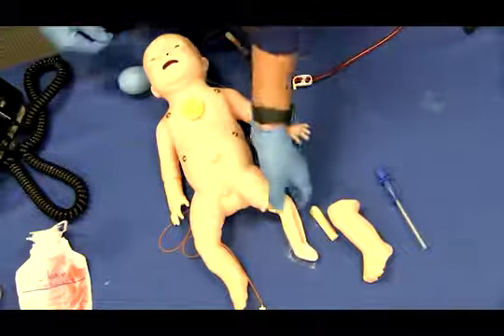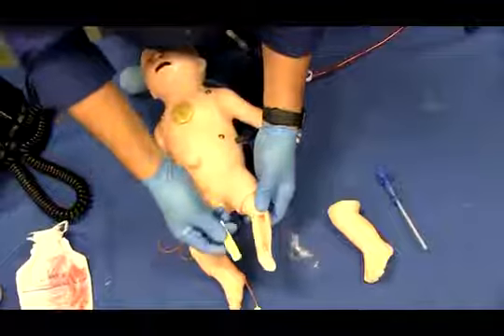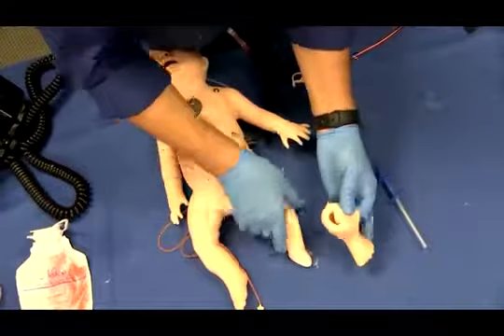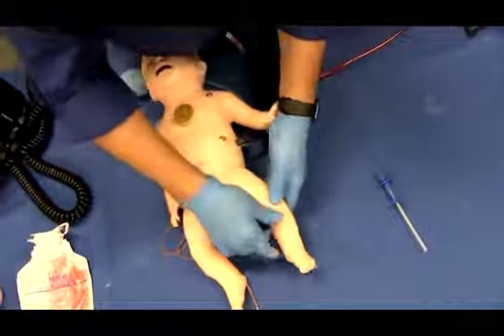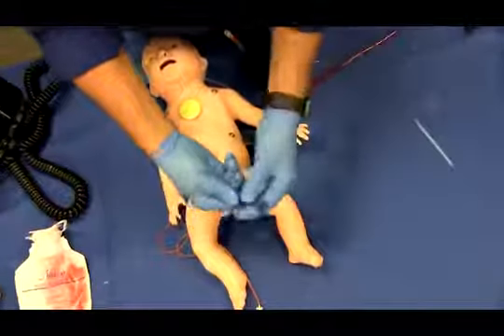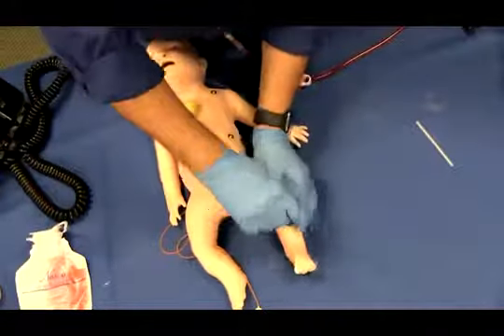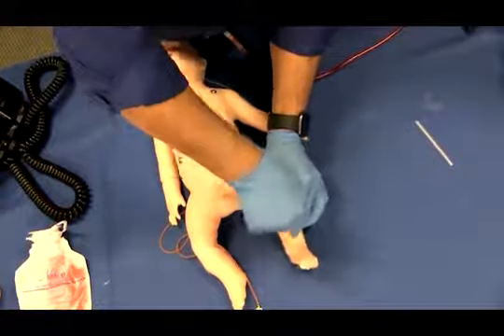Intraosseous infusion. Charlie's left leg incorporates an intraosseous infusion feature. Install the pre-filled bone and foot skin over the leg per previous instructions. Palpable landmarks include the patella and the tibial tuberosity. Any commercially available intraosseous device may be used to place the needle. A blood flashback will occur when the needle is properly inserted. Bones can be punctured multiple times before replacement.